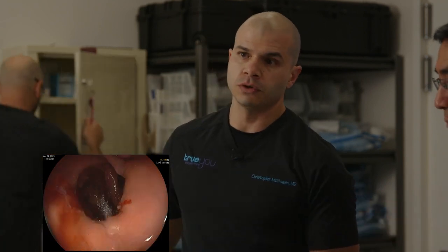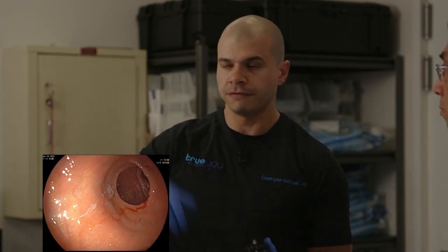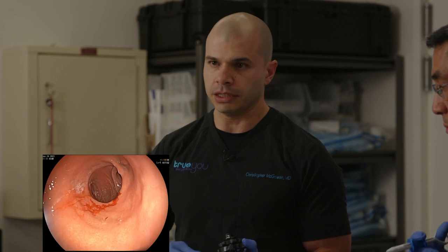A little bit of oozing is normal. A little bit of bleeding is normal. So just be aware, if you're watching this, there can be a little bit of blood during this procedure. We are ultra magnified here, so it's actually a lot less than it appears.